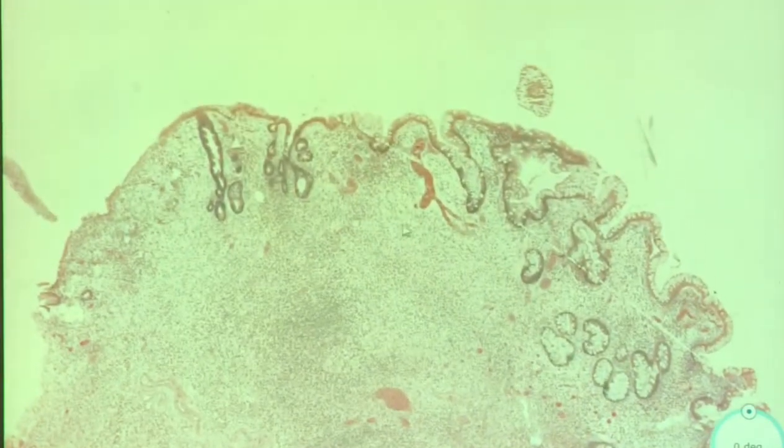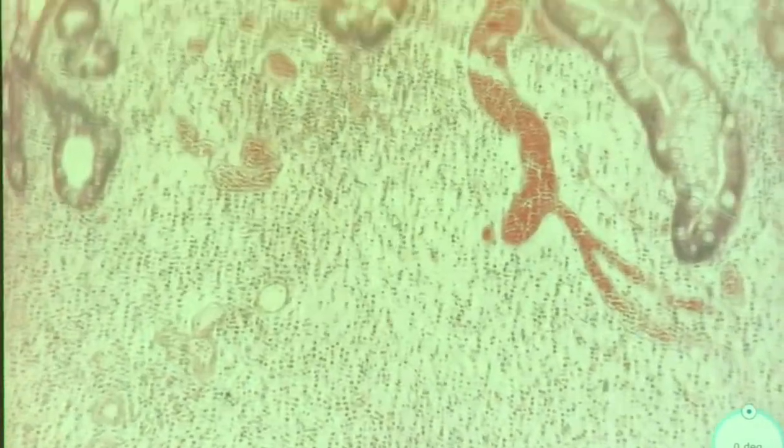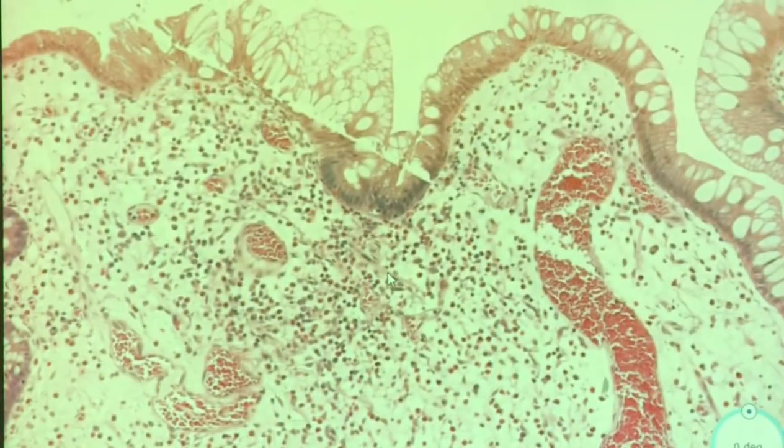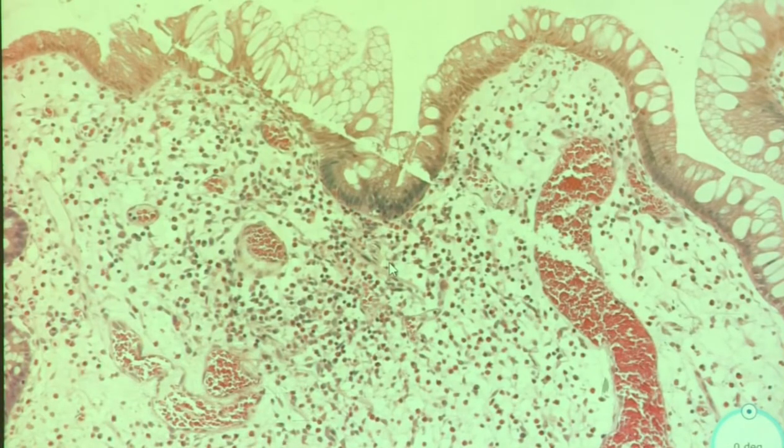And we could look at all of them, but we won't. The small bubble. This is colon. Wait, why are these villi? Why are these villi? You see those, they seem villous. Oh, this is a polyp. Maybe that's why. It's a polyp. So polyps can have a large variety of architecture, and they can be confusing.